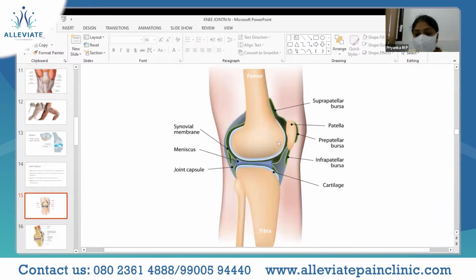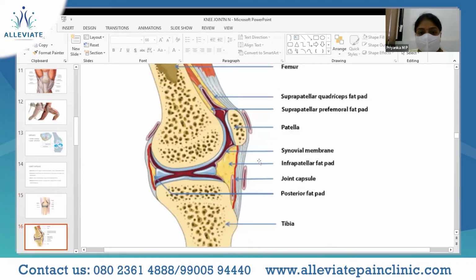In this image, we are seeing that the suprapatellar bursa is directly connected to the knee joint. So it has a direct connection with the inside of the knee joint. And there are a few fat pads around the knee joint. Those are the infrapatellar fat pad, also called Hoffa's fat pad. And on the superior side, there are the suprapatellar or quadriceps fat pad, and below that the prefemoral fat pad.